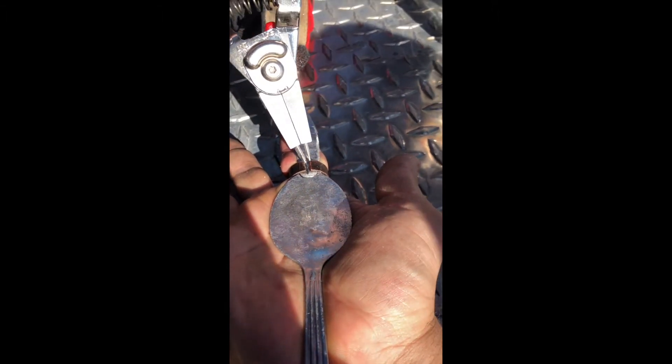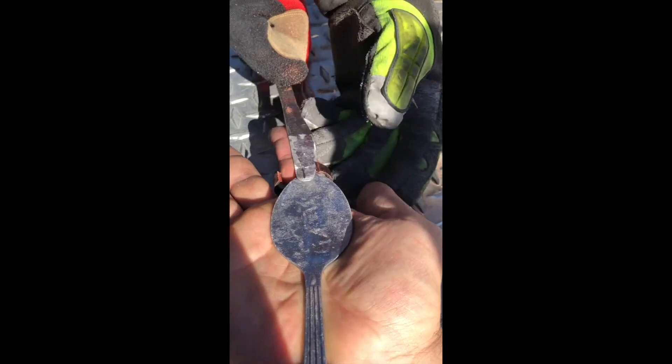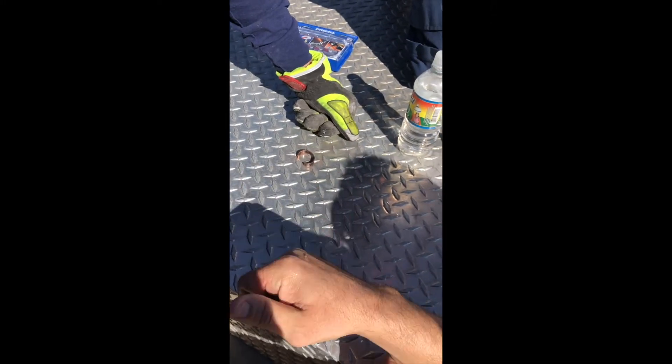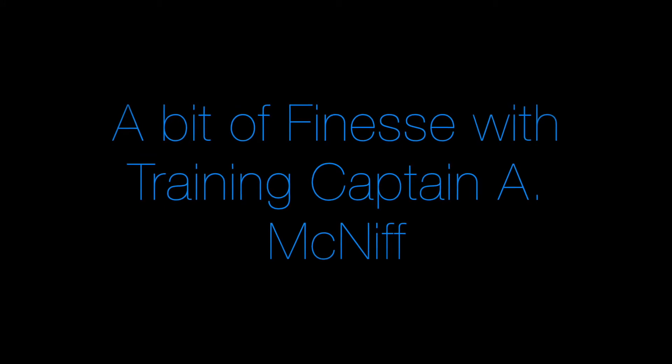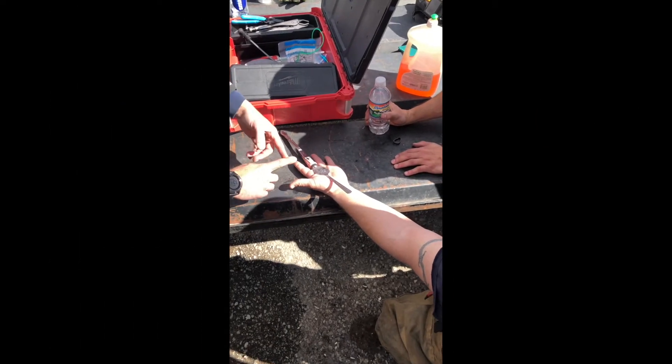Now get some ring crimping tools — pliers — get the tips in there, and just widen them open. That's how you properly take off the ring. Check on the patient: are you okay? Good.